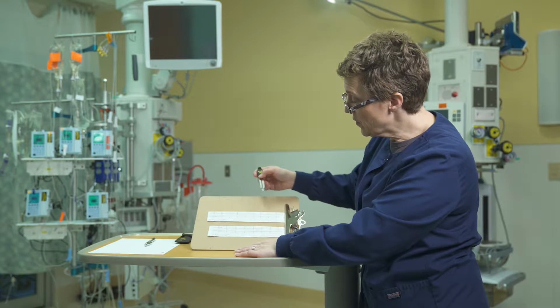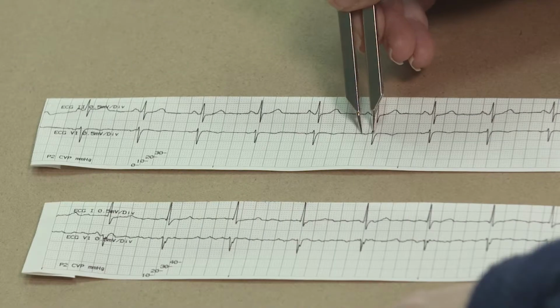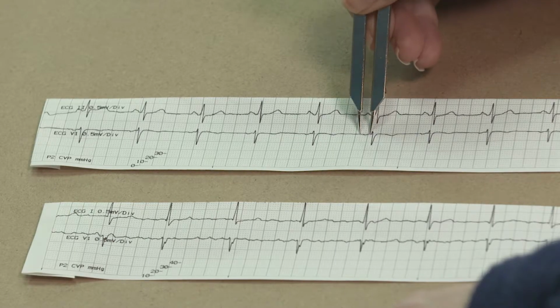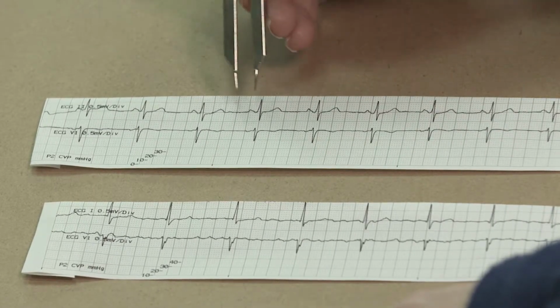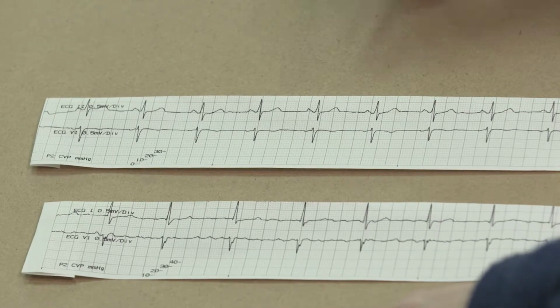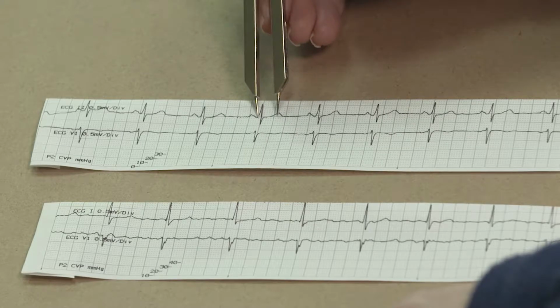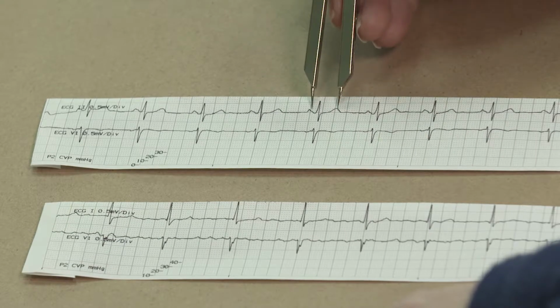You can use either of the waveforms if you're not sure. Sometimes it helps to actually measure on the other one to see if that one is better and if it's the same. So my last measurement that I will do on the waveforms is the QT interval, which begins at the first upward deflection all the way to the end of the T wave where it returns to baseline.